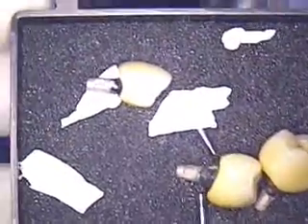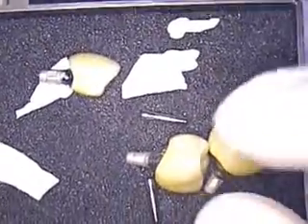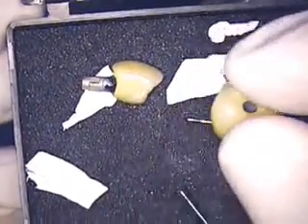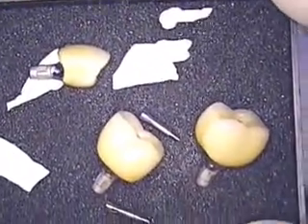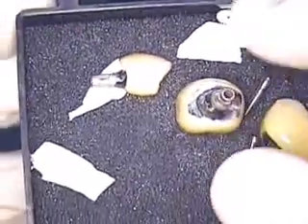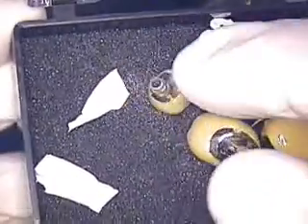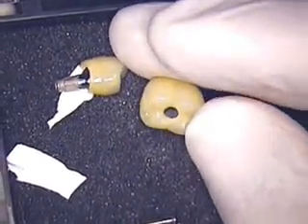Just to show you what's on the screen right now, these are the three implant screw-retain crowns that will be placed today. We have two molars and a bicuspid. You can see the modified ridgelap on the bicuspid and the two molars, which show a very highly polished undersurface. Later in the video we'll show you the molar that has more of a convex surface than a concave, which is necessary for cleansability and good tissue adaptation.